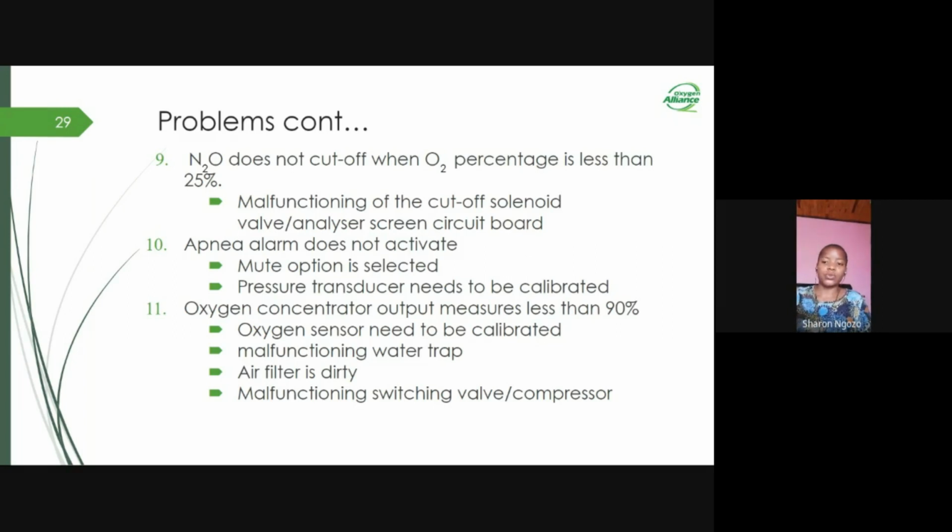The other cause is where you have the air filter is dirty and is obstructing the airflow. So you need to clean it up, or if it needs replacing, then go ahead and replace it. The other cause might be where you have the air compressor malfunctioning. So you need to check that. Also, you can have the switching valve malfunctioning. So you need to check these and fix them.